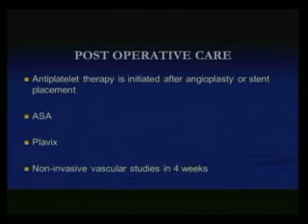And I usually see them in the clinic. You get non-invasive vascular studies, duplex, ABIs, and then I compare it with the preoperative non-invasive vascular studies and see how the intervention has helped the patient, and talk to the patient about the symptoms as well. So this was from pre-op, getting the patient to the operating table, analgesia, balloons, catheters, very basic stuff. I think we use it every day.